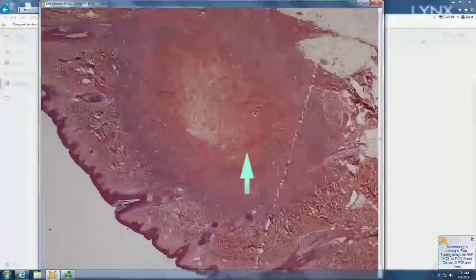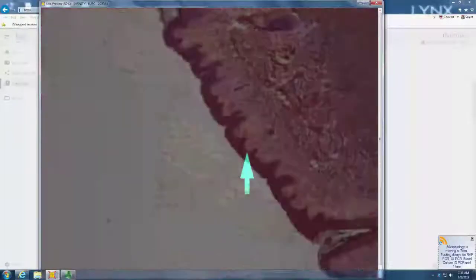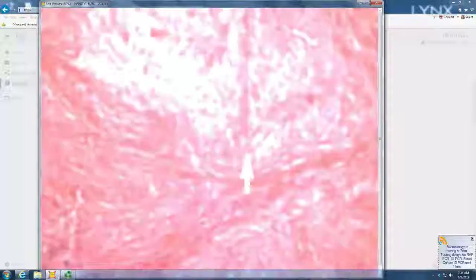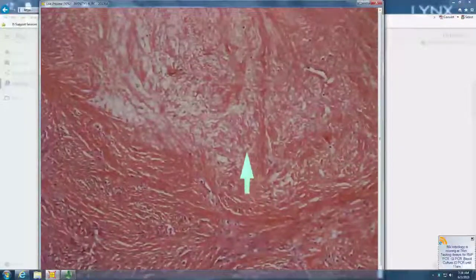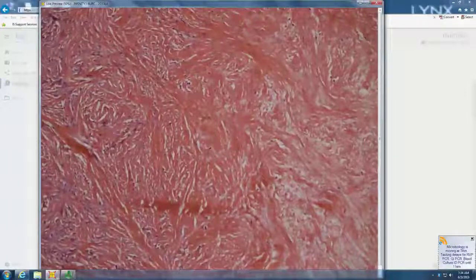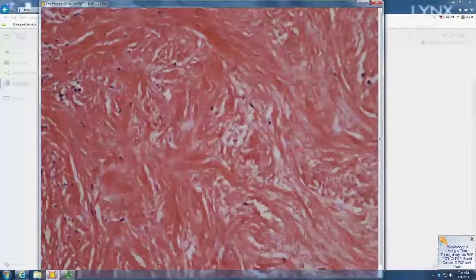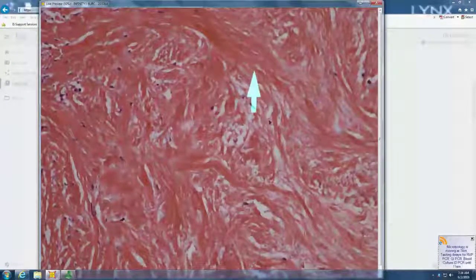Area of necrosis with clefting. So area of necrosis, or at least pallor and some edema, where the collagen becomes hypocellular. So then the question is, is it really amorphous, or can you still see ropey fibers?